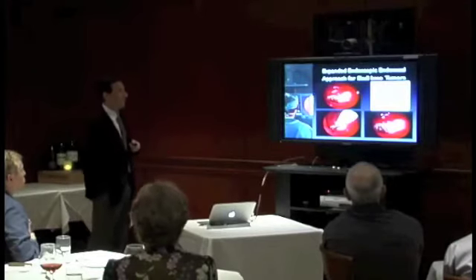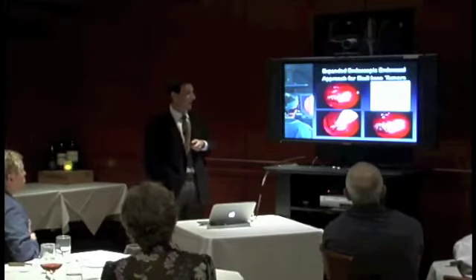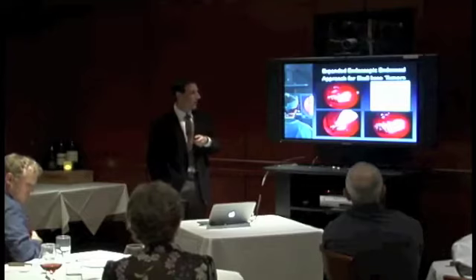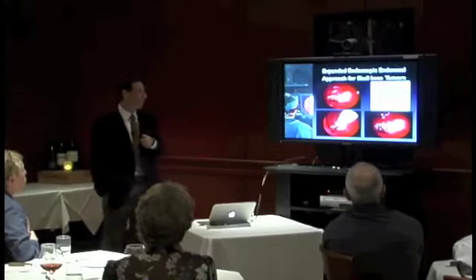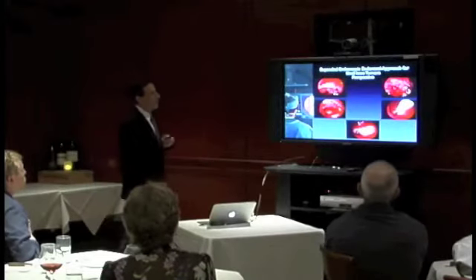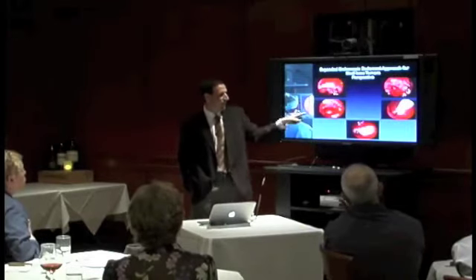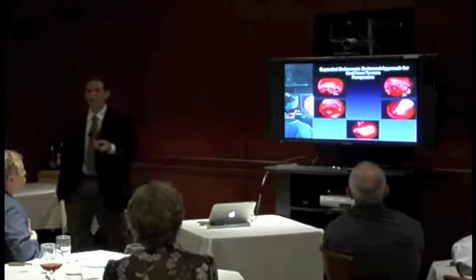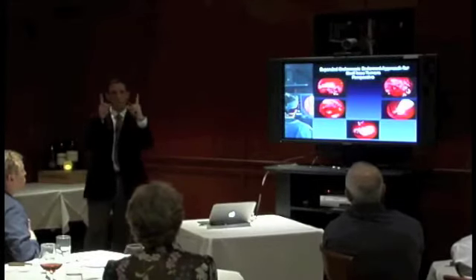This patient did fantastic. They ended up being in the hospital, I think, for about 5 days. They're now neurologically normal, and they haven't had any tumor recurrence in 5 years. So it was a great benefit for that patient. To give that perspective, this is the opening that we had in the sella, and we continue to advance the endoscope until we get into the third ventricle. So things are tremendously magnified, and we're probably about that far into the nose when we're doing that surgery.